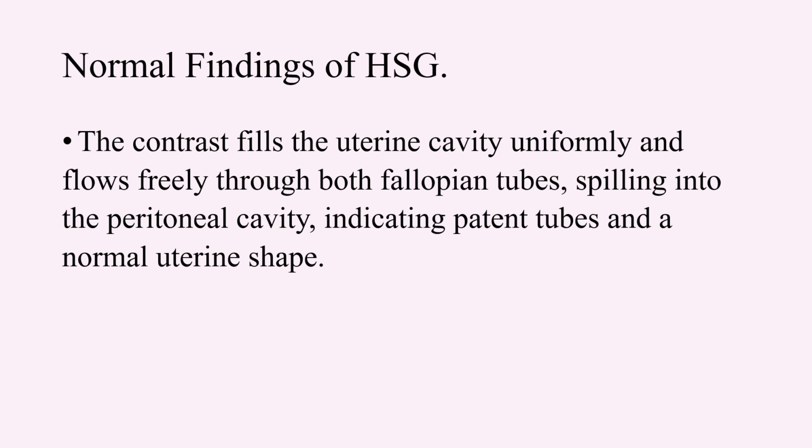In case the fluoroscope is not present, static films will be taken, firstly as a control image before the introduction of the dye, then at the time of the introduction of the dye, a few minutes after the dye has been introduced, and then 10 to 15 minutes later. This helps to ensure that false negative results are reduced in case there is a tubal spasm at the time of insufflation of the dye.